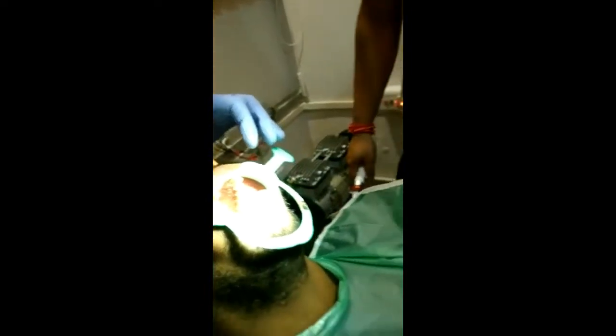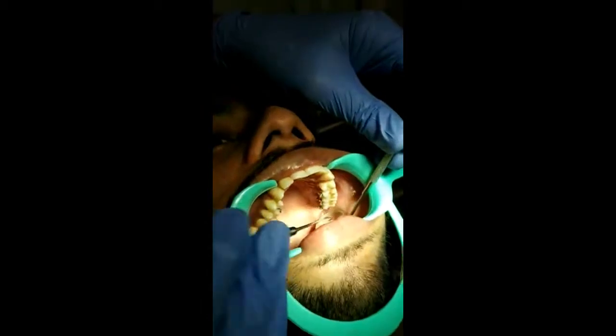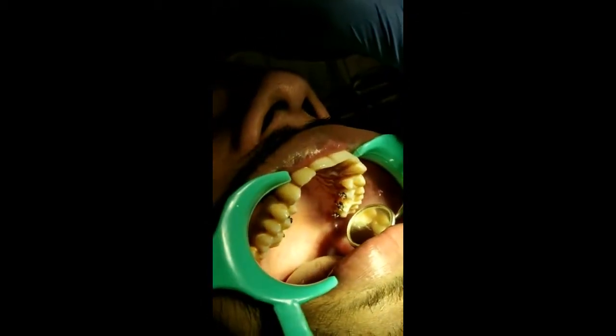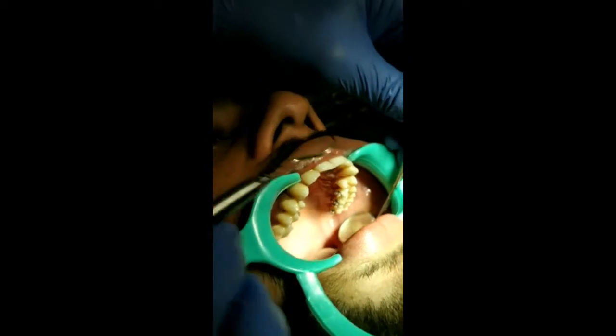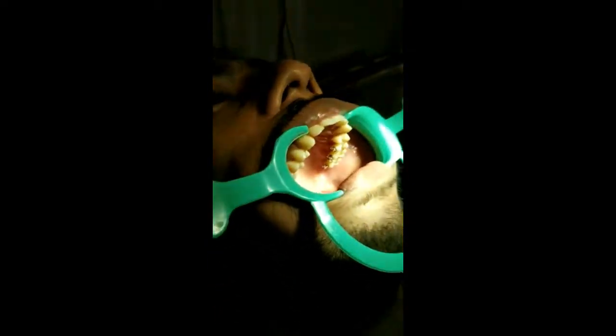As you can see, after the curing is done, we have removed the tray. And the brackets are in position on the teeth. We'll just check if they are bonded properly, moment of truth. And it looks fine. The patient is good to go.